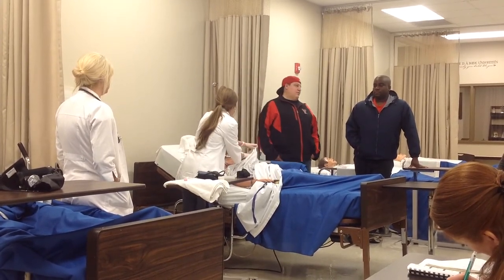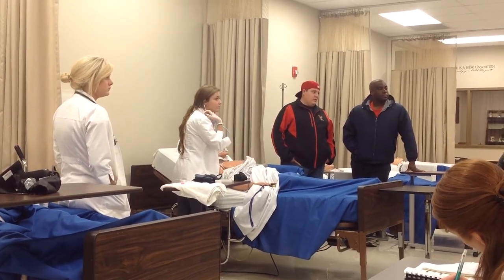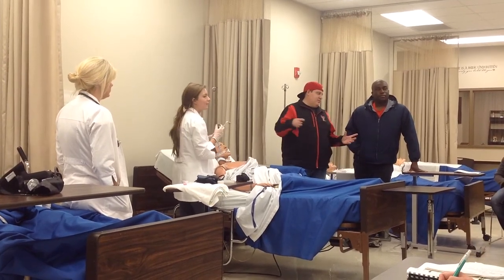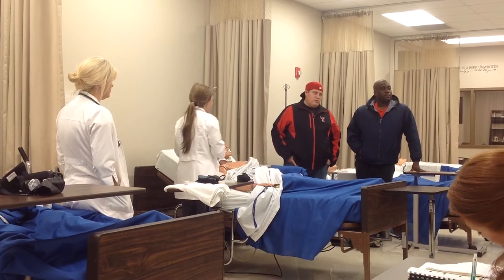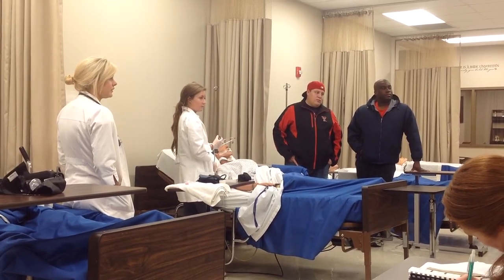Are you going to say something? I was going to say, the Yankauer, you don't just place it, you put it back in the sleeve. And then you put the plastic it came out of, and then you put it under the pillow or back in the drawer. I would just leave it connected to the tubing and put it back in the sleeve.